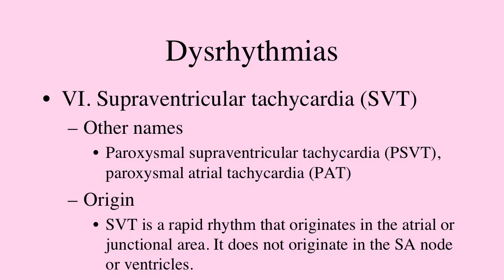But again, the main thing you want to look at is page 53, where you have normal complexes that go real fast going in and come out real fast, and they essentially look normal. It's just that they're fast. This may or may not be significant.